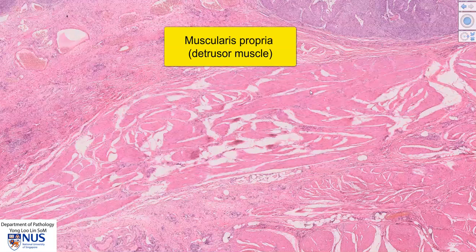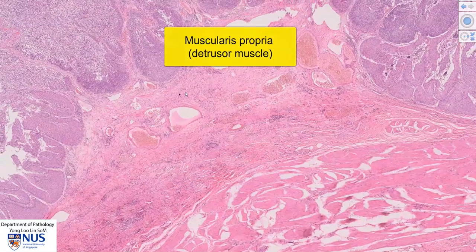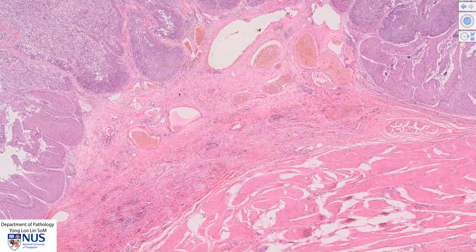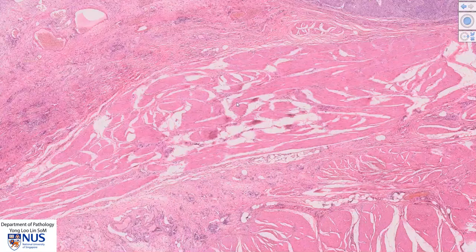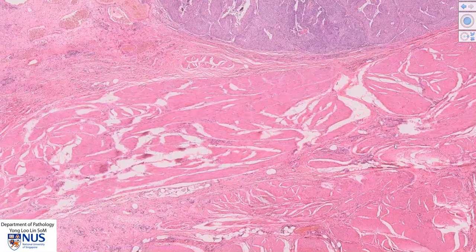This is very important in staging because tumors that infiltrate into or through the muscularis mucosae are still within the lamina propria of the bladder wall, whereas tumors that go into the muscularis propria or the detrusor muscle are at a higher stage.